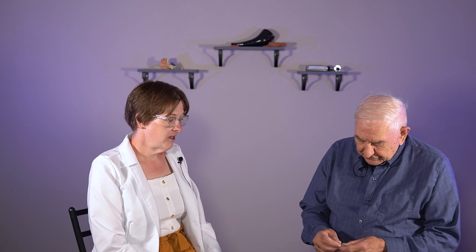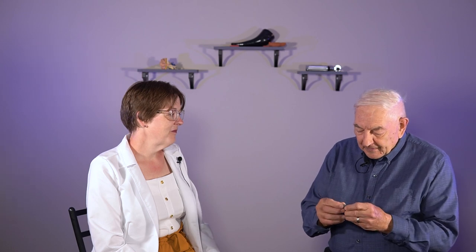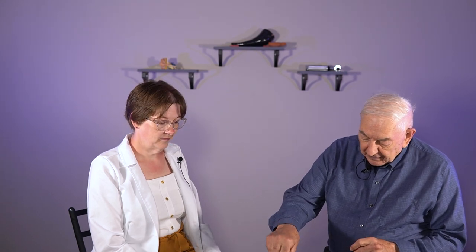This hearing aid insert tool — six months ago I got a set of hearing aids from Hearing Solutions, and I always had trouble putting them in my ear. I said there must be a better way. So I came up with this little tool to put your hearing aid in. First of all, you take your hearing aid like this and hold it on the receiver, and let this fall down like this.